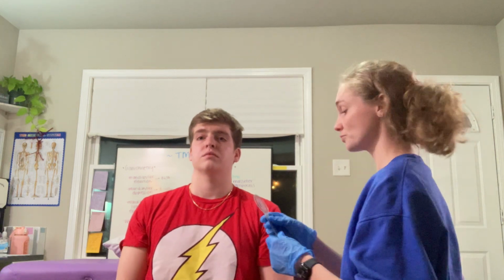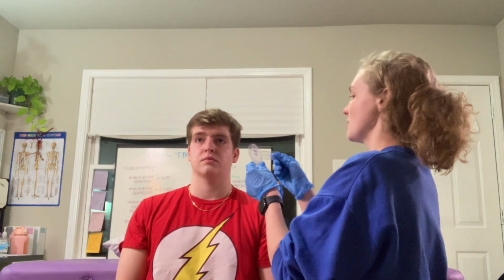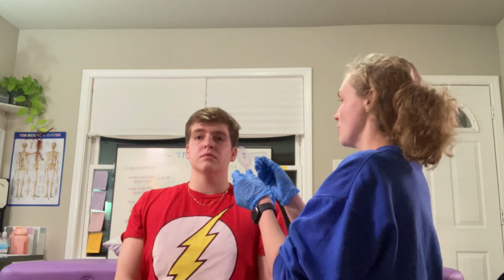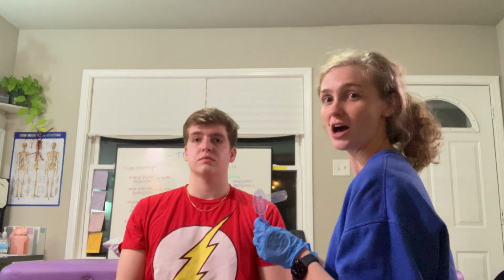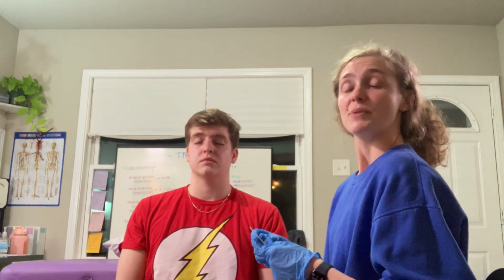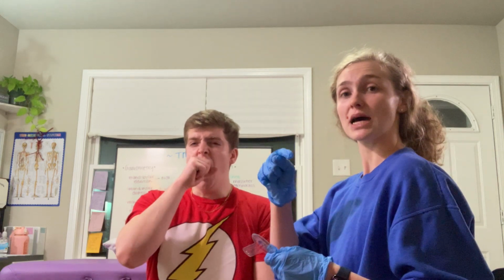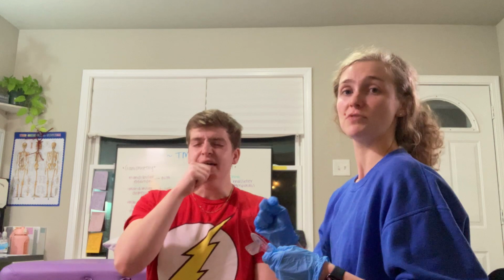It is important to make sure that the patient is sitting in an erect sitting position as well as feet flat on the floor. I'm going to be using the stationary arm for my measurements today because I like it the best out of everything on here. So the landmarks that we are going to be measuring from for mandibular depression is going to be the bottom of the top teeth and the top of the bottom teeth.